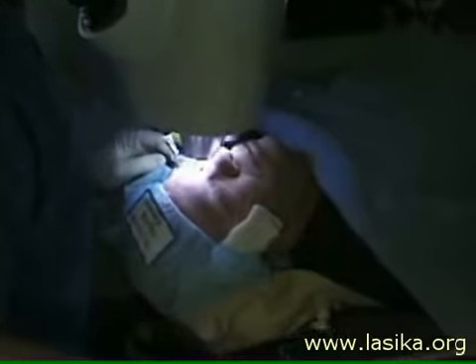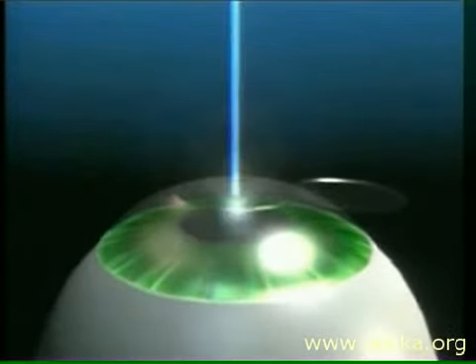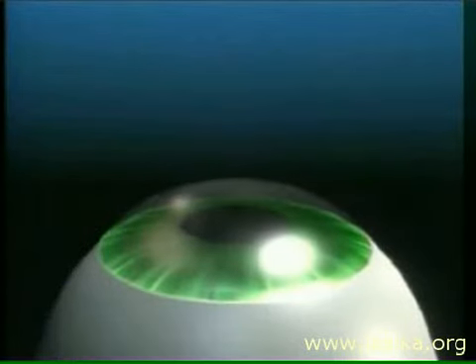There are two steps involved in the LASIK process. The first step is the creation of a flap. After the flap is created, the flap is then lifted and the treatment is then placed on the stroma of the cornea. After this point, the flap is then returned to its original position.